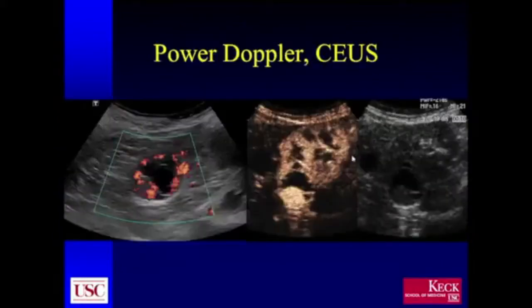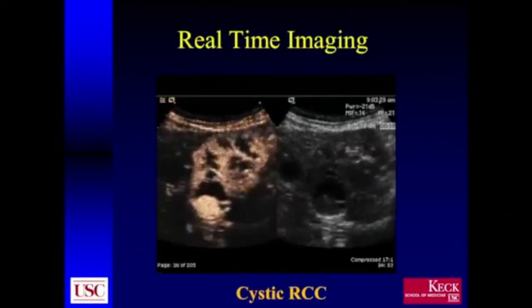On the contrast ultrasound, I think you can very nicely see here is the normal parenchyma. This is obviously early in the nephrographic phase. You can see the pyramids are standing out. There is that cystic area that was seen on the MR, but importantly, on the edge of this mass, you can see there is a solid structure, which is, again, hypervascular to the surrounding renal parenchyma and clearly suspicious for a renal cell carcinoma.